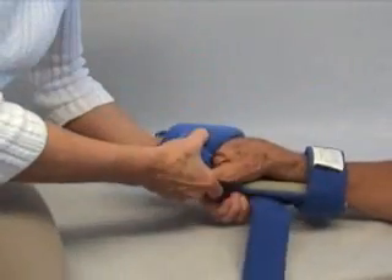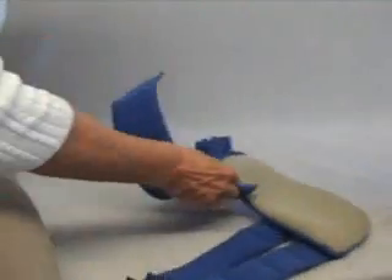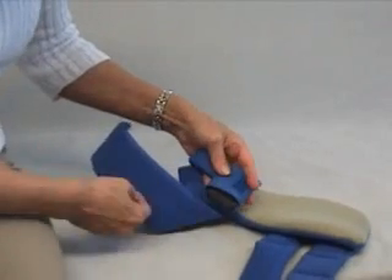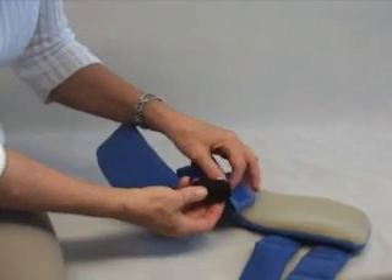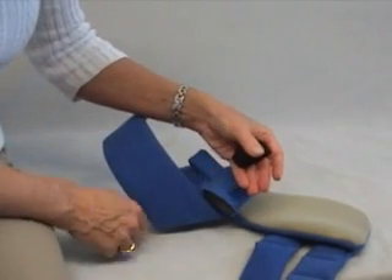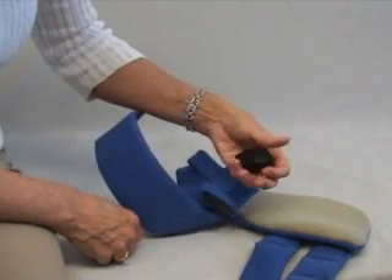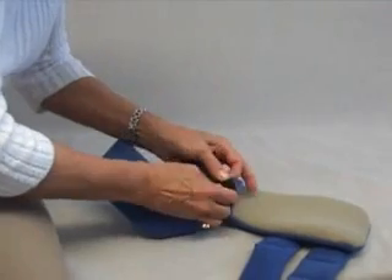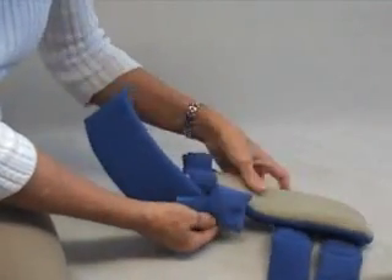As your patient improves, or if it's appropriate from the beginning, there's a pocket in the back under the thumb. You can put scraps of foam material, or use the piece that comes with your Thumbies — it's designed to let the thumb rest in a little trough. You would slide this in the material and then your patient's thumb would fit over that.